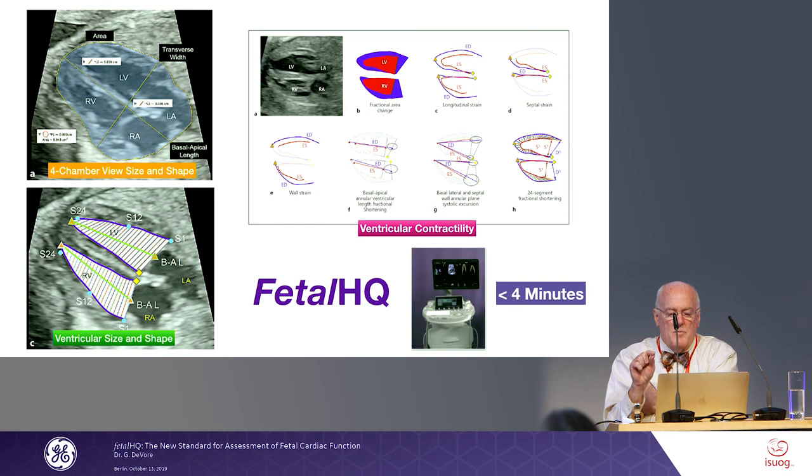But basically, what I've shared with you, all these measurements from all these papers have been now incorporated into the GE system using the TomTec measurement tool, and the GE folks have done a wonderful job of taking those raw data and putting them into graphical form, z-score values, so you can actually see the interpretation. And it really takes less than 4 minutes to do.